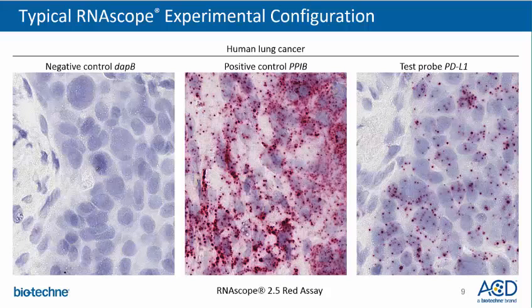For more details on how to get started with the RNAscope assay and troubleshooting, we refer you to previously recorded webinars available through our website.